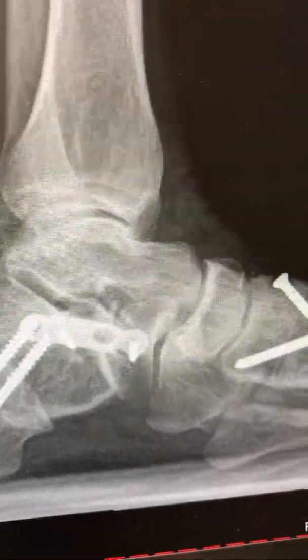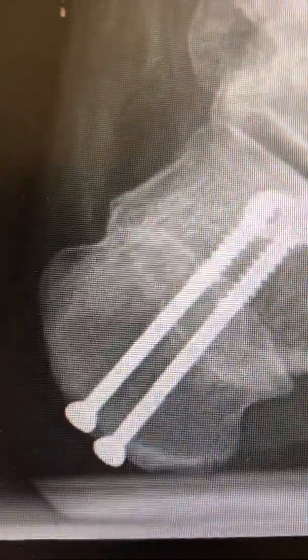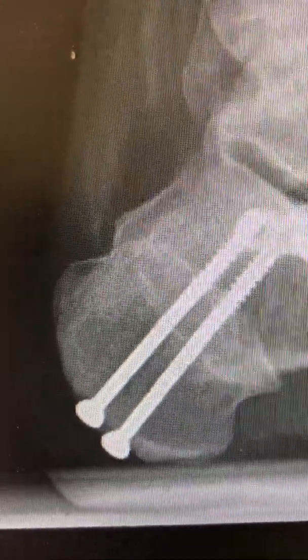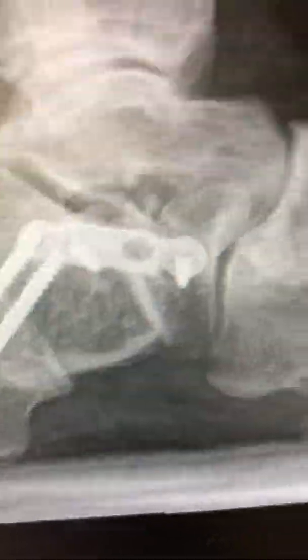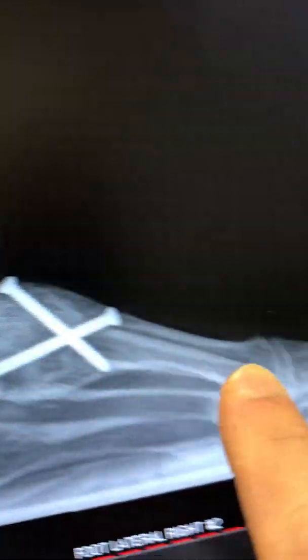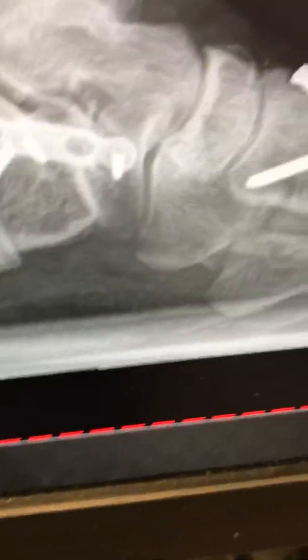We can also compare the sagittal view — we can see the Simline right there, there's no more break in it. Those corrections were done by another provider, as well as the frontal plane, which was done by another provider two and a half years ago. I think there was no need for those to be addressed, as it was not a frontal plane anomaly — it was more a sagittal and transverse plane that was more dominant. Nonetheless, he's got an arch. There is something called Meary's angle, which is the section of this little bone called the talus shooting straight down to the big toe, and that's also aligned very nicely. So everything looks very, very good in regards to where he should be at seven weeks out.